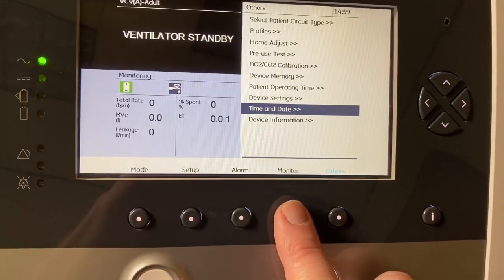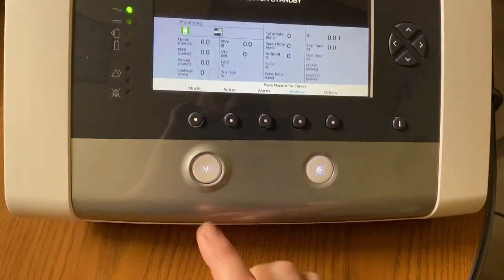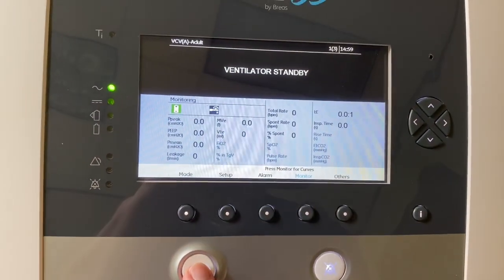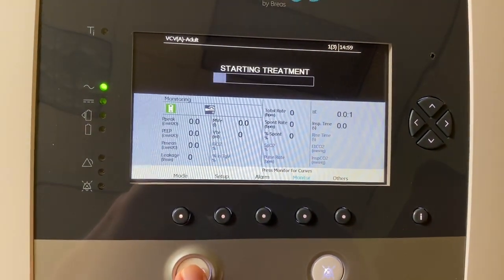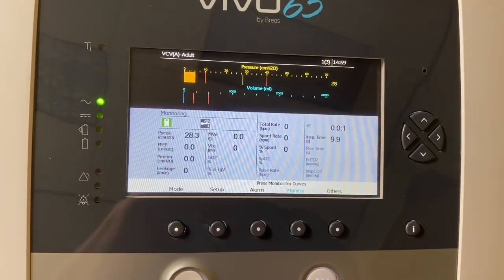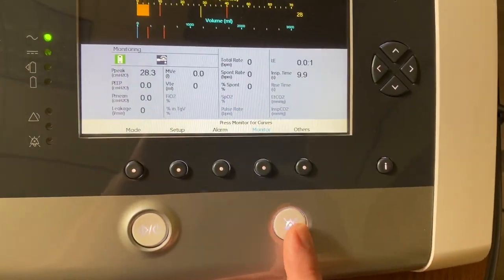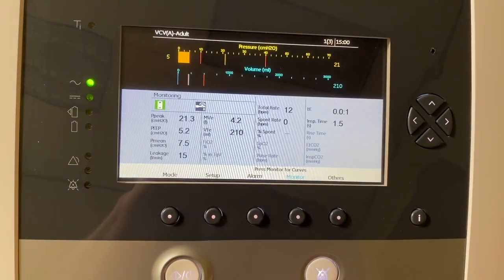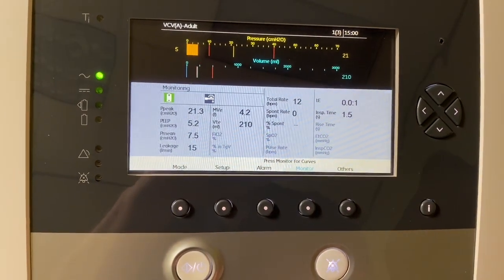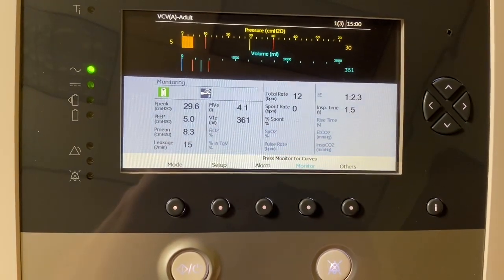I will go back to the monitor screen and power on the therapy. To power on therapy, you're going to press and hold the power button. The little bar is going to fill up — keep pressing and holding until that bar completely fills. Alarm silence right here will silence any alarms. You start to get your measured parameters that the patient is achieving.